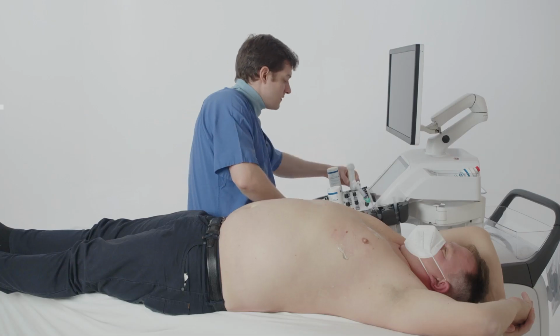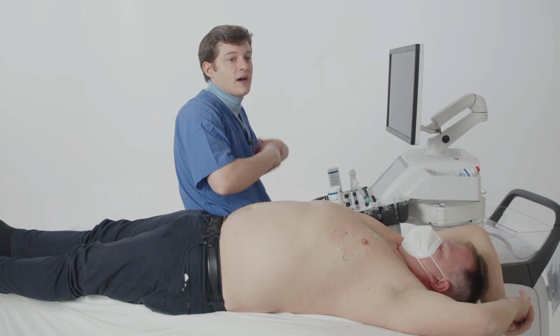So to summarize this imaging, we do have myocardial thickening. So in our evaluation, it turned out the patient has a hypertrophic obstructive cardiomyopathy. Well, we started treating, of course, with beta blockers, and the first gradient we measured when the patient visited our hospital was during rest 75 millimeters of mercury. Now we remember what we measured now. It's way, way, way lower, so approximately 15 to 20 millimeters of mercury.